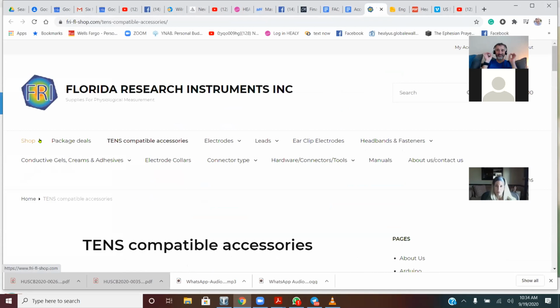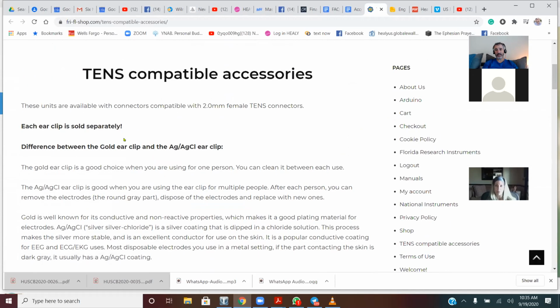When I use them, they sting. It kind of hurts, I feel it too much, so I don't even use them. If I have a program like that that I need to run, I use the sticky pads on my mastoids. Much more comfortable than the ear clips. I think you can maybe get felt covers over the ear clips so they don't zap you too much.